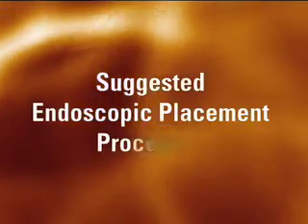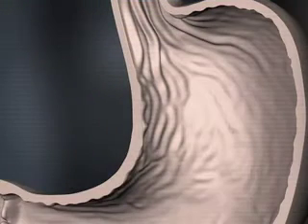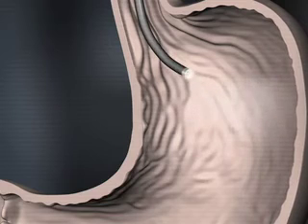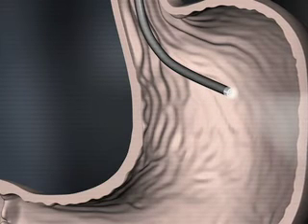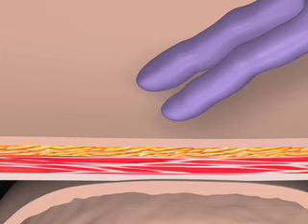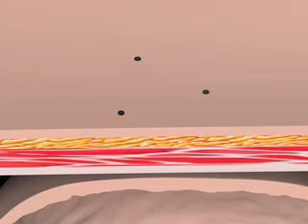Suggested endoscopic placement procedure: Place the patient in the supine position and insufflate the stomach with air. Transilluminate through the anterior abdominal wall to select a gastrostomy site that is free of major vessels, viscera, and scar tissue. Place a skin mark at the tube insertion site and define the gastropexy pattern by placing three skin marks equidistant from the tube insertion site and in a triangular configuration.